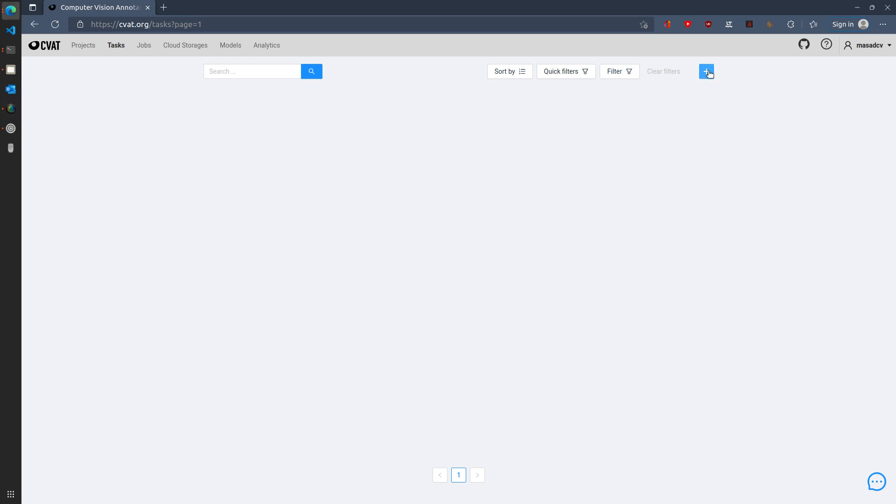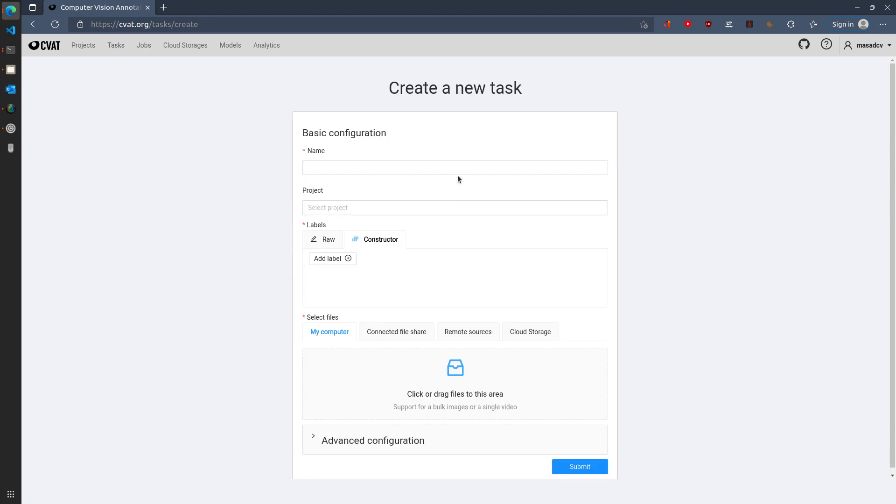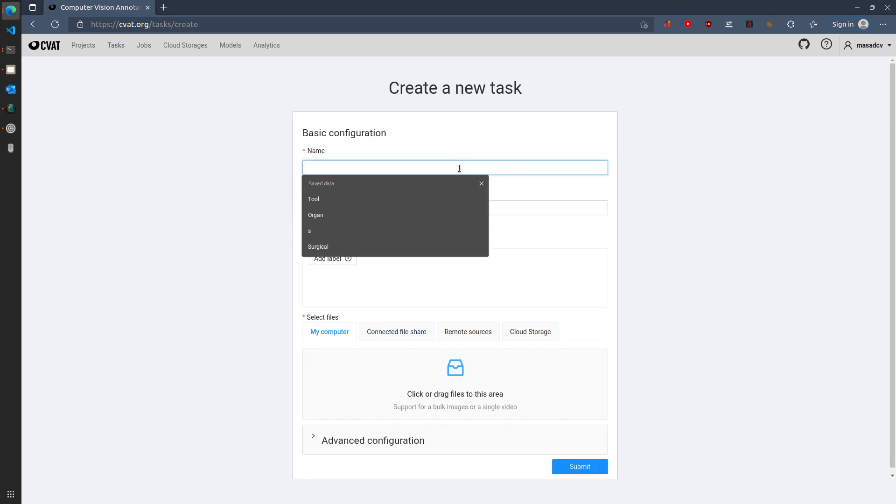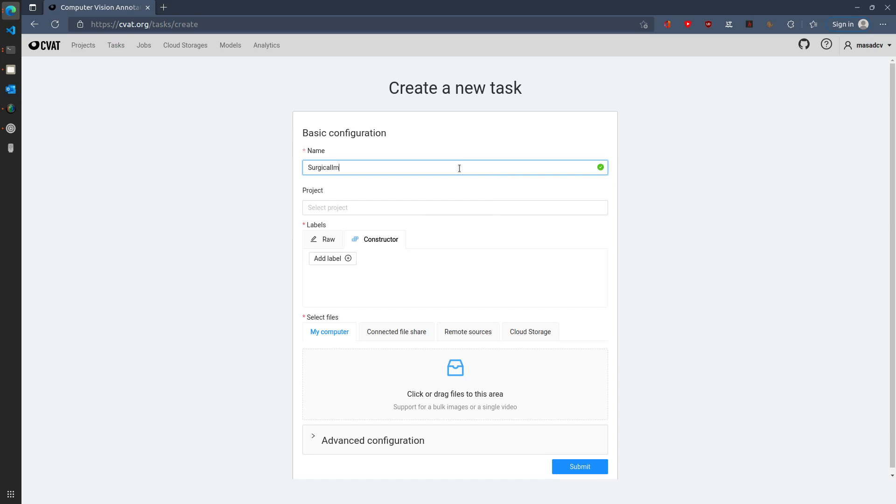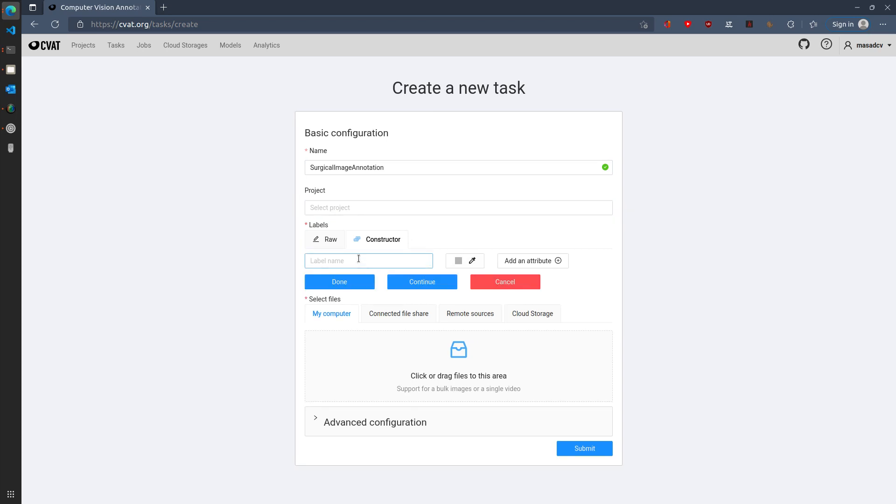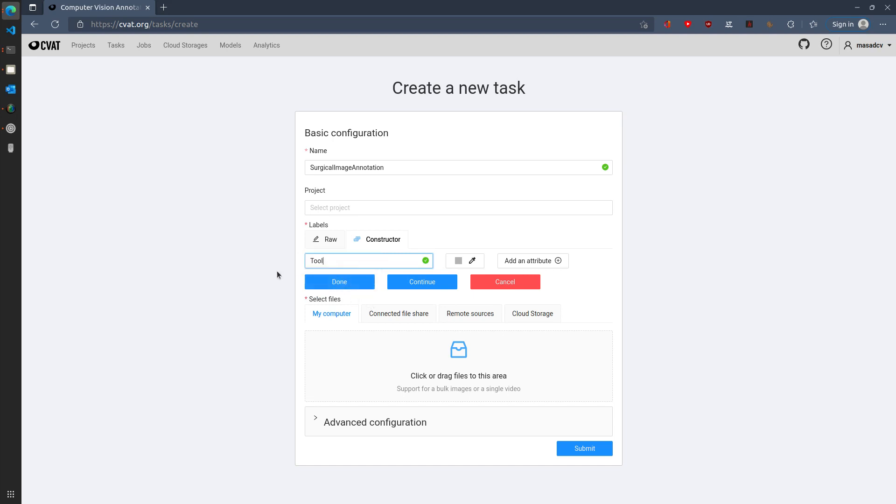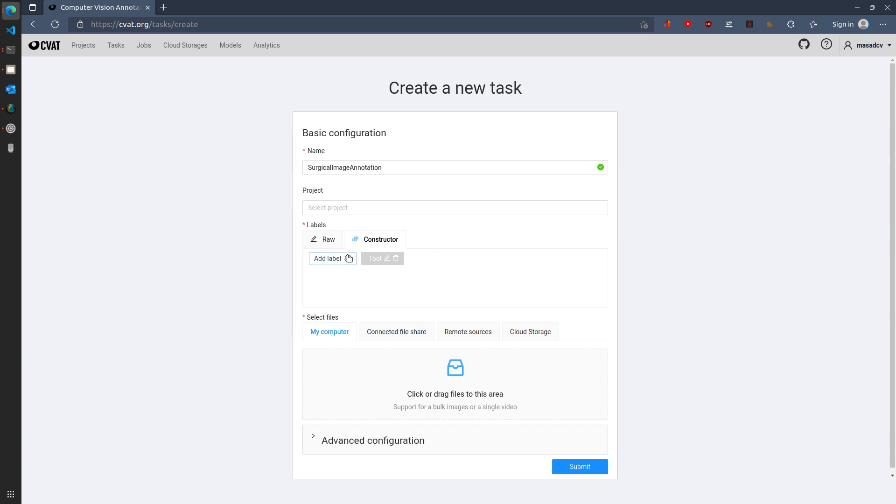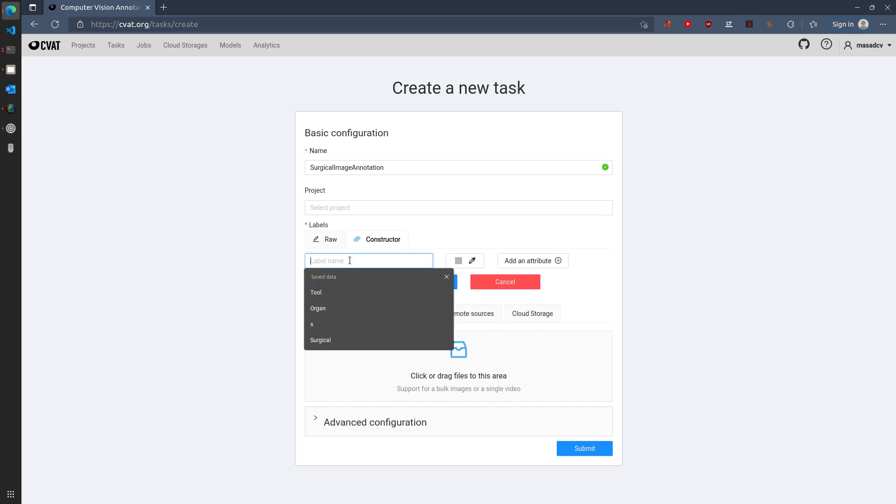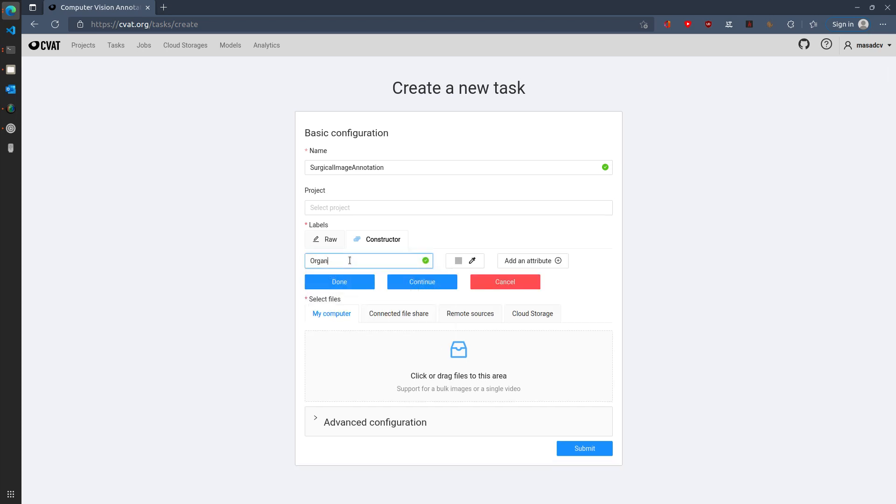For this tutorial, I'm going to add a new task. As I'm going to annotate surgical images, I will name this surgical image annotation. I can also associate a project with this task, but at the moment I'm just going to leave this empty. And then I can also give it what I am going to annotate in terms of the labels. So I'm going to add annotations for a tool as well as for the different organs.